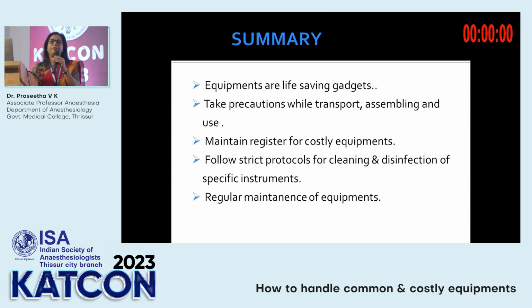Why? Because you care for that. That is your own equipment. But these equipments are more important and life-saving. So please care for them also, and take precautions while you are transporting them, assembling them, and using them. And maintain a register. That is a very practical way. We have a register, but things don't always work out. So maintain a register for costly equipments.